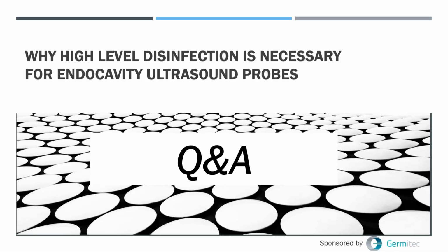The second is it is almost impossible to physically remove a probe cover by pulling it off and have 100% assurity you're not contaminating the underlying probe. So if you have even gloved hands and you accidentally touch the probe cover to the probe as it's being removed, or your hands which have touched the patient's mucous membranes now touch the probe, then you will contaminate it. And again, that's not visible.